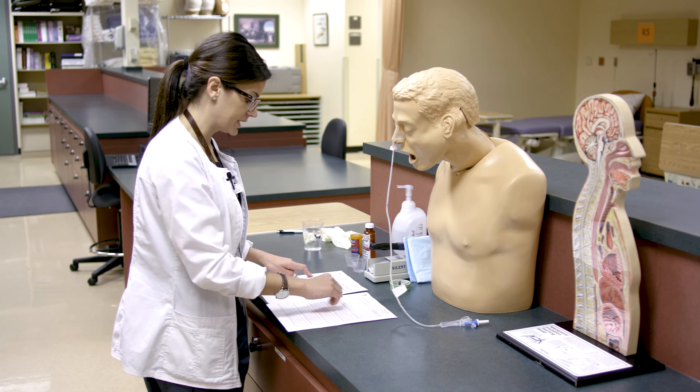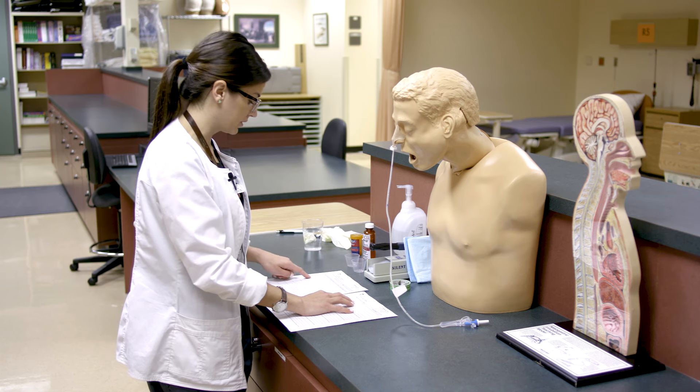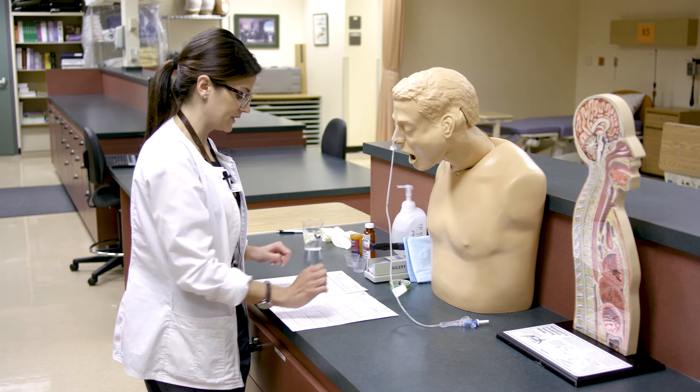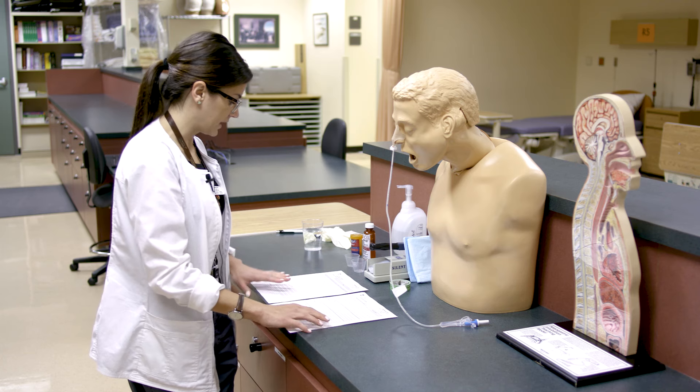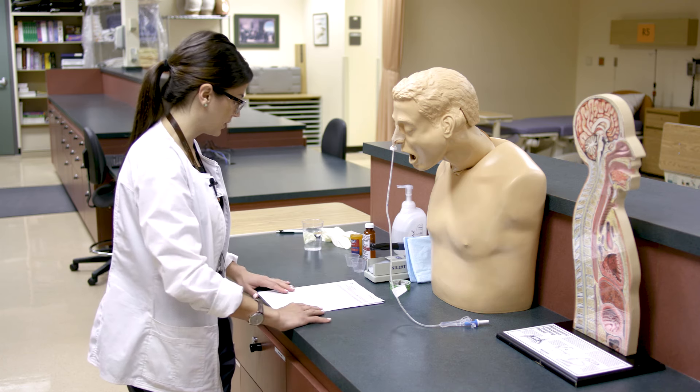He has also ordered Dilantin 125 suspension, 250 mg per NG once daily. That is in fact correct on the MAR, so we're going to go ahead and prepare our medications.